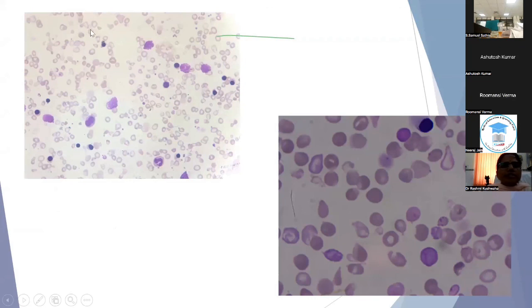We see large amount of anisocytosis. We had seen in the CBC also, RDW was greatly increased. There is presence of the teardrop cells. We can see certain microcytic hypochromic cells, certain macrocytic cells, large number of nucleated RBCs, presence of these smudge cells. This is a closer view showing the presence of the Cabot ring, the basophilic stippling in these cells. And of course, the transfused cells were also present.